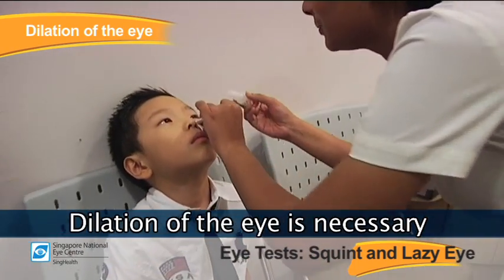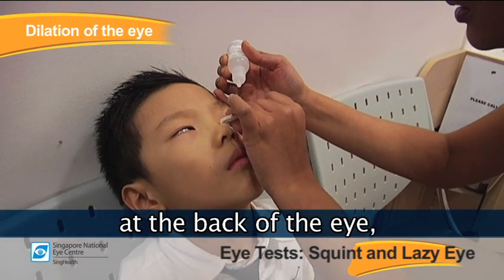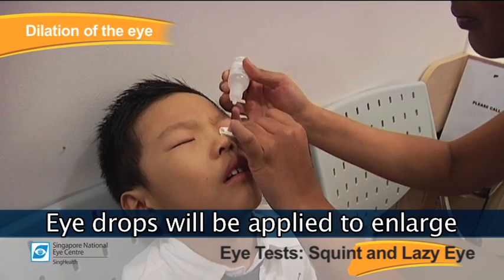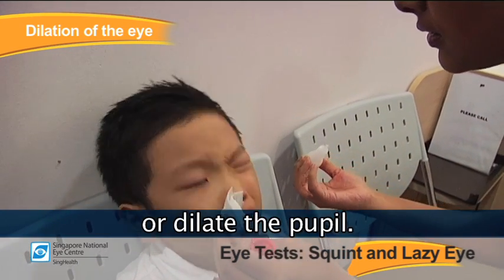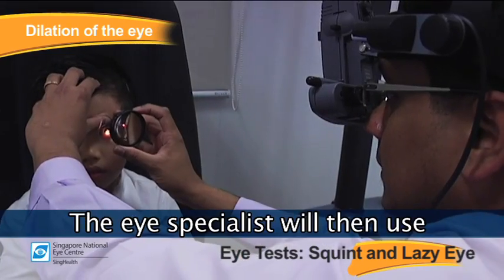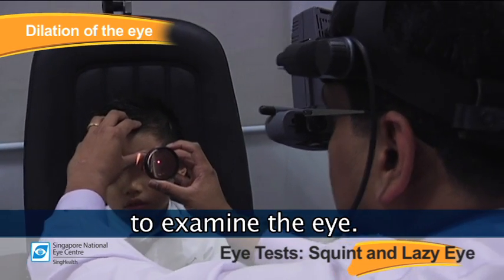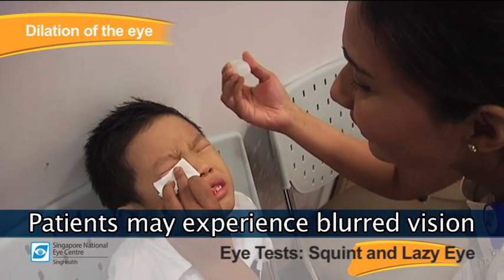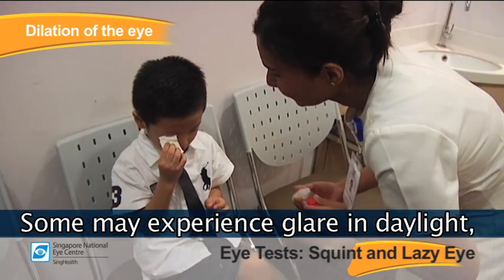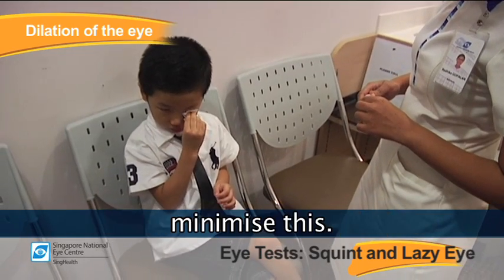Dilation of the eye is necessary for the eye specialist to examine the optic nerve at the back of the eye, as well as to determine if there are retinal diseases. Eye drops will be applied to enlarge or dilate the pupil. About 20 minutes is required for the eye drops to take effect. The eye specialist will then use an instrument known as the ophthalmoscope to examine the eye. Patients may experience blurred vision after dilation for up to 4 hours, and some may experience glare in daylight. Wearing sunglasses may help to minimise this.